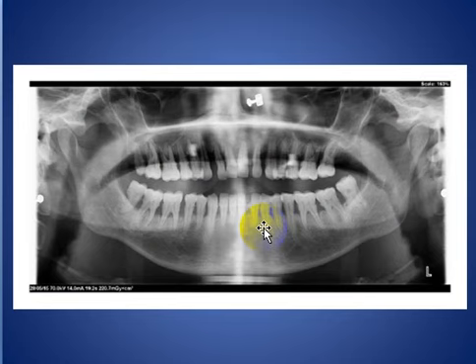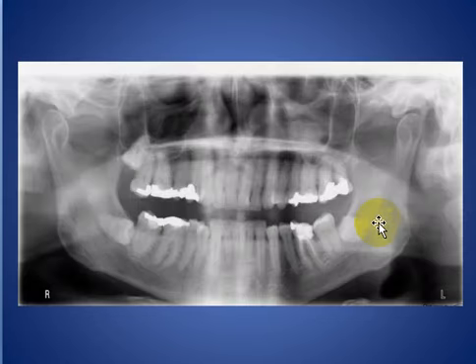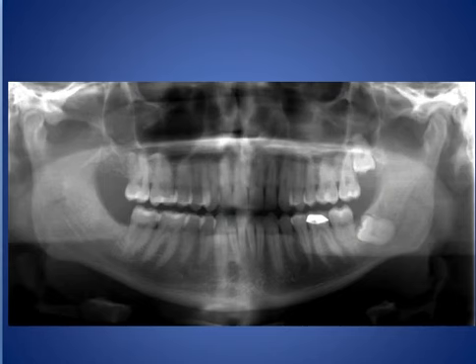Here this is a normal bone panorama. Here we see a panoramic X-ray with impacted lower wisdom teeth, as we see here, and a restoration of the teeth here, with metallic restoration, amalgam. Here another patient with impacted left mandibular third molar teeth.